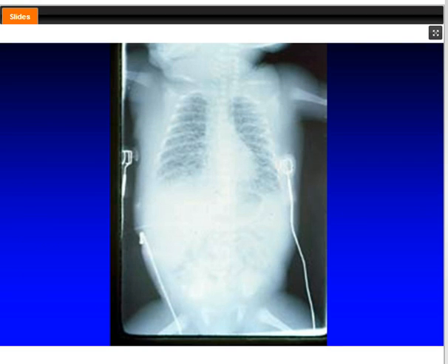And this is a baby with fairly severe PIE. And in fact, this baby, I would tell you that you would probably want to consider using a somewhat slower frequency. The reason for that is there is so much interstitial air, it is compressing the airways, and it's giving the baby a predilection to air trap, and therefore using frequencies that are somewhat slower may be more beneficial for a baby who's this overdistended with PIE.